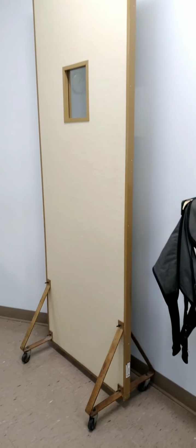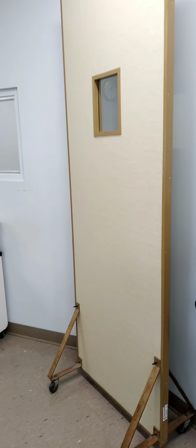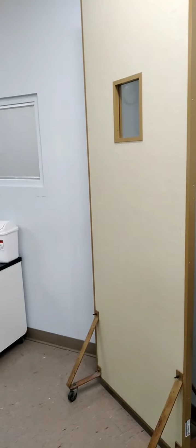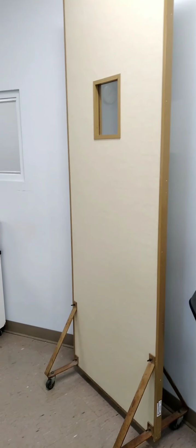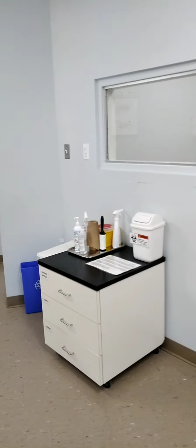This big contraption on wheels is a lead barrier. So if we can't make a quick getaway and we have to stay in the room, we can hide behind this if an x-ray needs to be taken and you can't step away from the patient further than, like, trying to sneak behind the lead glass.